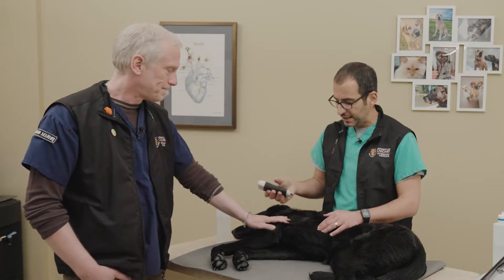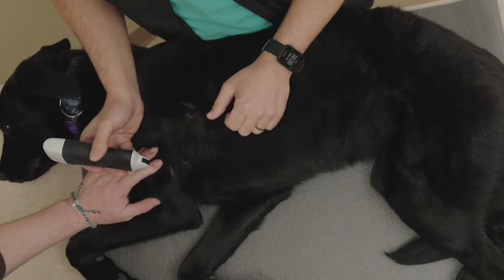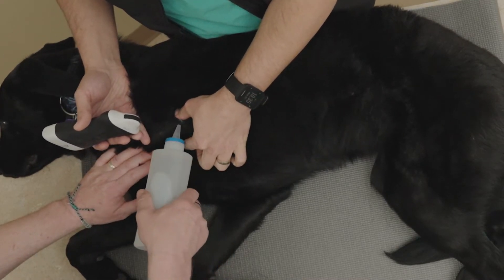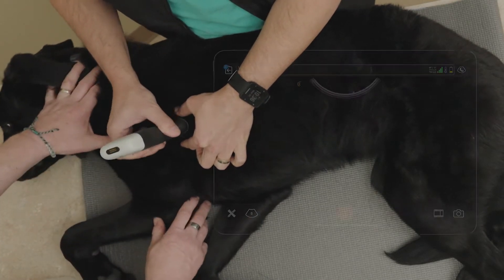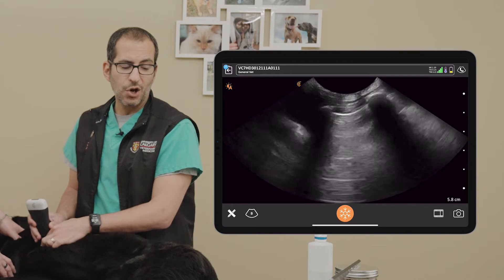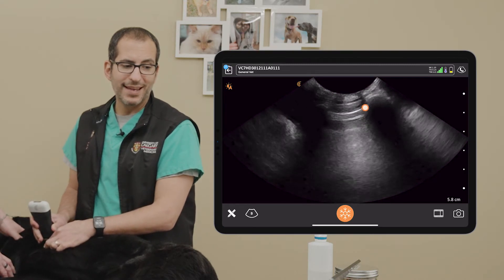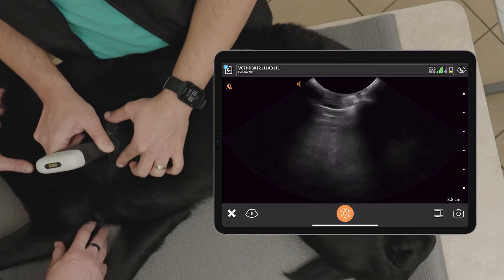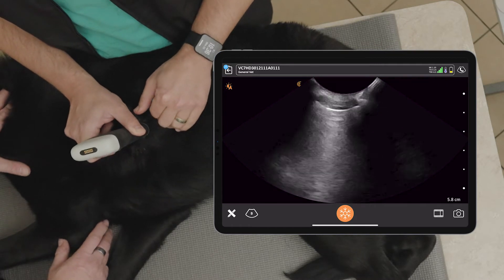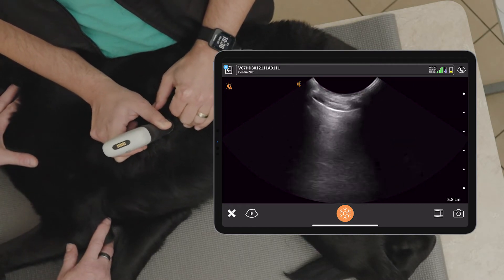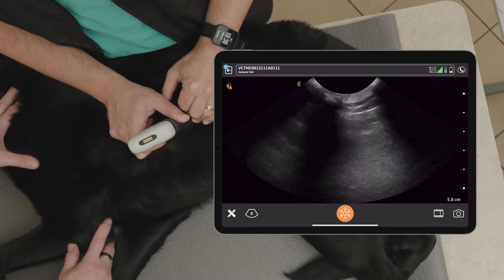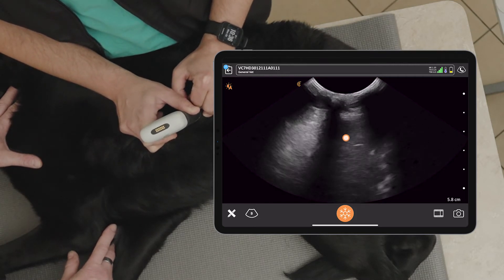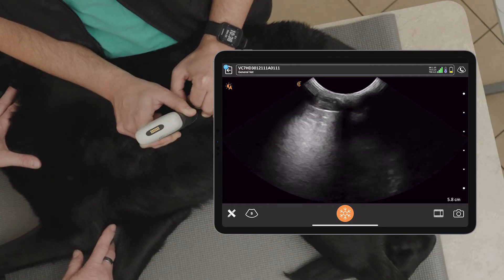Let's go ahead and do this. We're going to start at our cranial PLUS border, because we're sure we're going to be over lung. Dr. Boisin, I'm going to part the fur and move that skin forward to limit how much alcohol we use. We can find our pleural line, bat sign. Do we have a glide sign — yes or no? We can see that shimmer there. I'm at the cranial border, and I'm going to move backwards until I find that caudal border, which we've identified as the curtain sign. There we go — there's a lovely curtain sign, our vertical edge artifact.